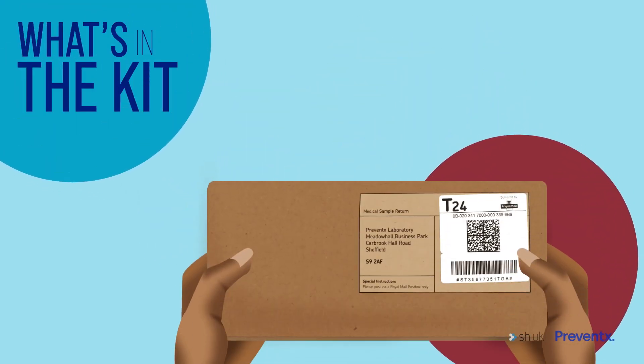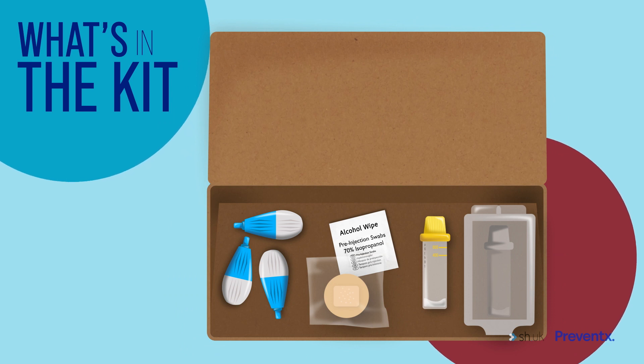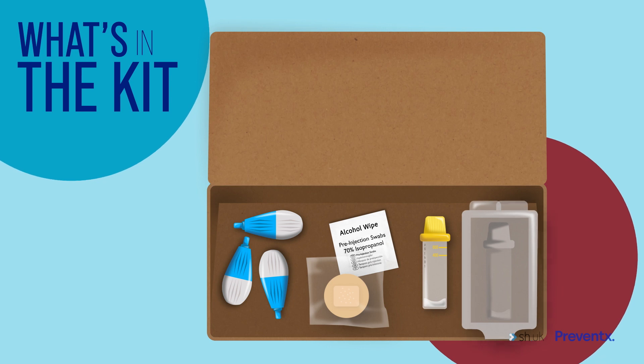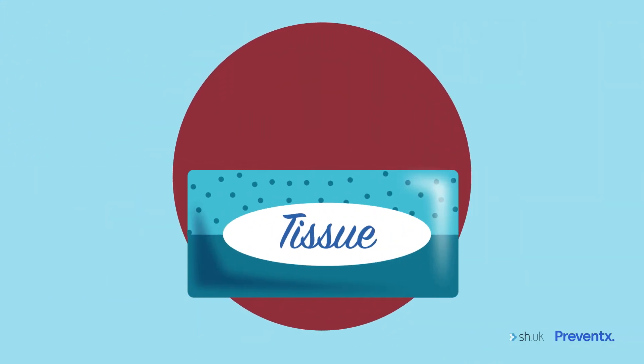Let's get familiar with exactly what we've got in the kit. You have a wipe to clean your finger, lancets to prick your finger, a tube to collect your blood, a transport case, and then a plaster for when you're done. The only thing we don't include is a tissue, so grab one before you start.